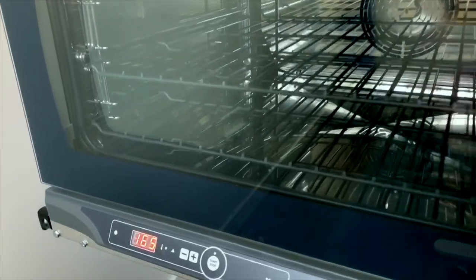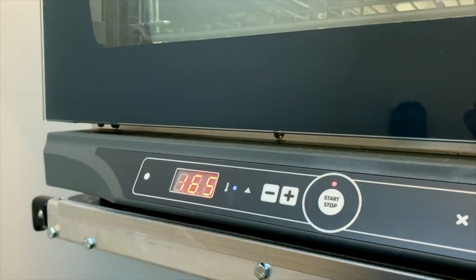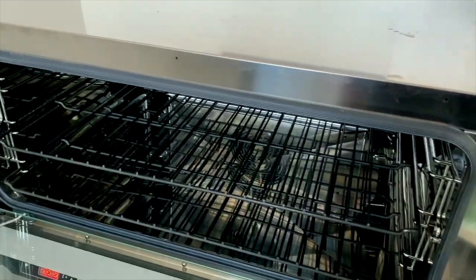The oven is preset to 165 degrees. All you need to do is turn your oven on and let it heat to temperature. Then place the mask on the rack.